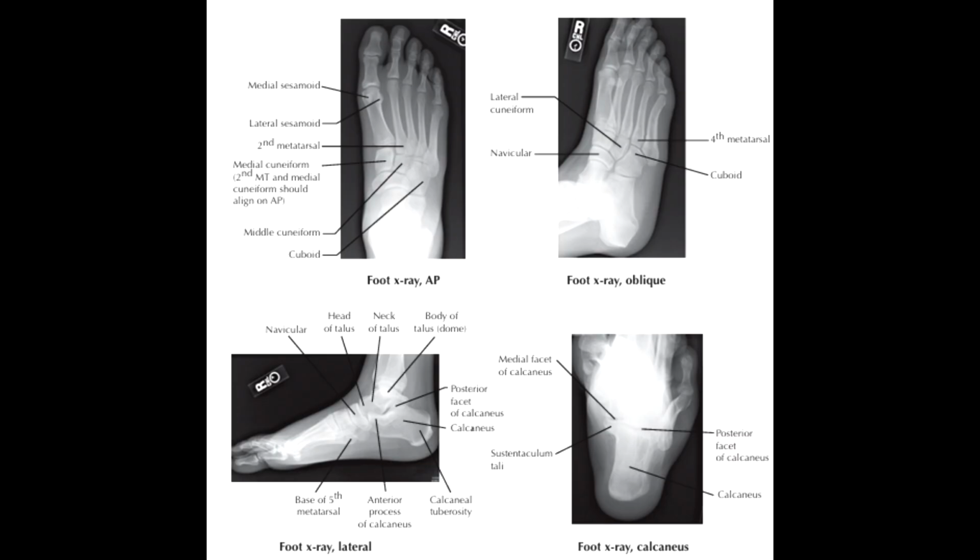And so, as we conclude this section, remember, to truly master the anatomy of the foot, one must see it not only in cadaveric dissection or schematic drawings, but also through the lens of radiology. Because in practice, it is through these images that most diagnoses are made, most fractures are classified, and most treatments are planned. Radiographs are the bridge between anatomy and clinical medicine.